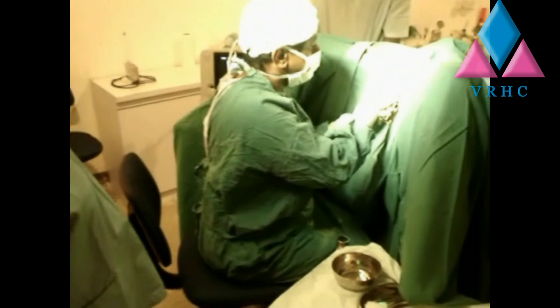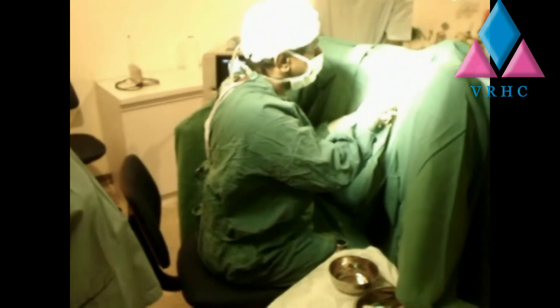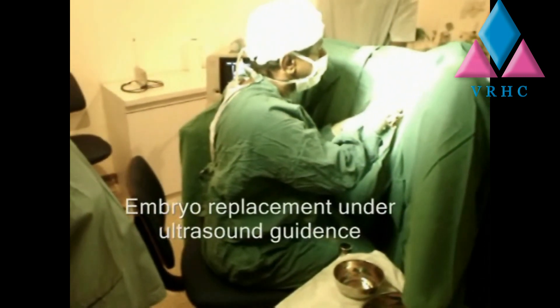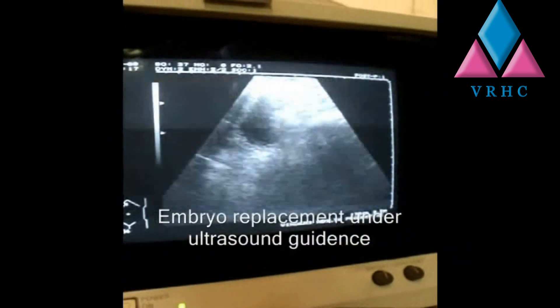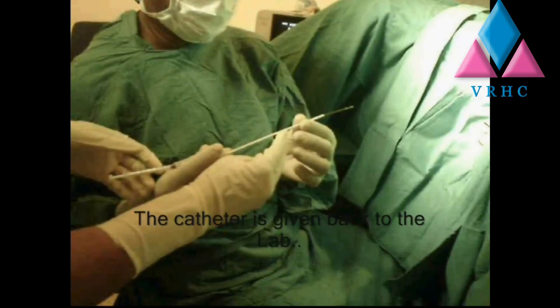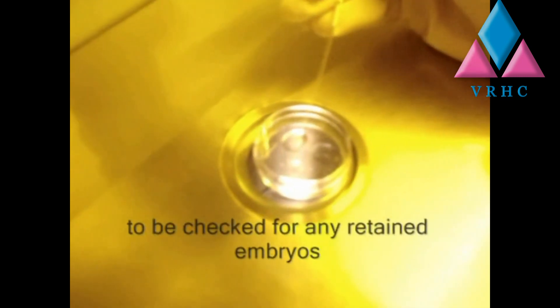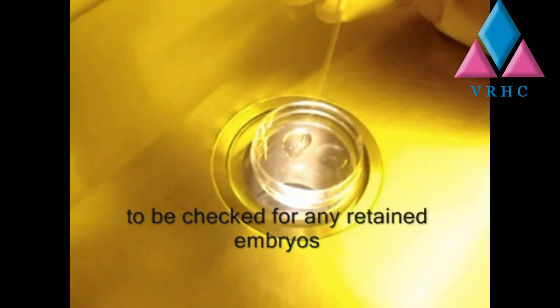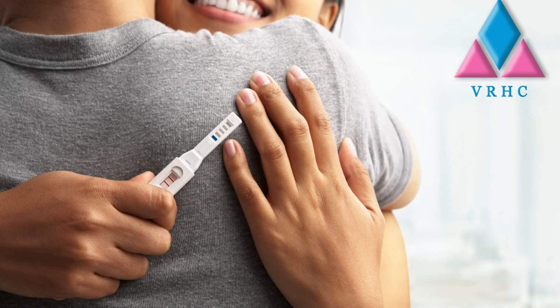A trial catheterization is done on all patients before commencement of the IVF cycle. The replacement is usually done one centimeter below the fundus under ultrasound guidance. After embryo transfer, the patient is supplemented with progesterone for a period determined by the clinician. The catheter is returned to the embryologist to inspect for retained embryos. Two weeks after embryo replacement, serum beta-HCG is tested to determine the outcome.